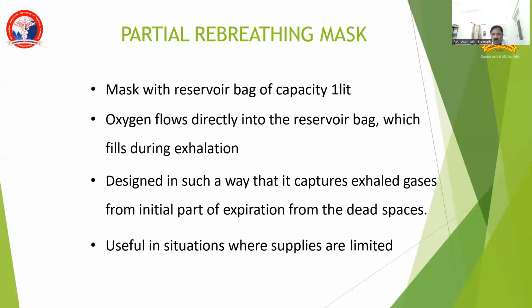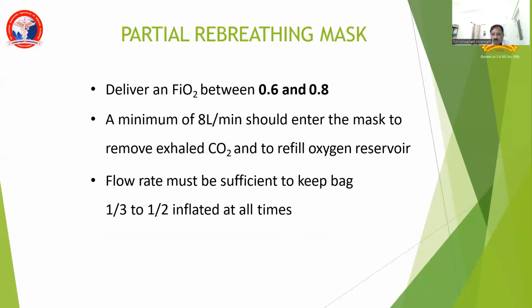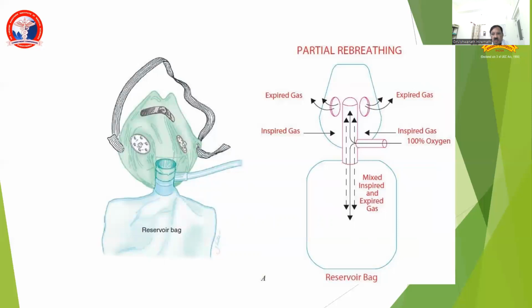Designed in such a way that it captures exhaled gases from the initial part of the expiration from the dead space. Useful in the situation where the supplies are limited. So here, during inspiration, the patient receives oxygen from the inlet as well as from the reservoir bag.